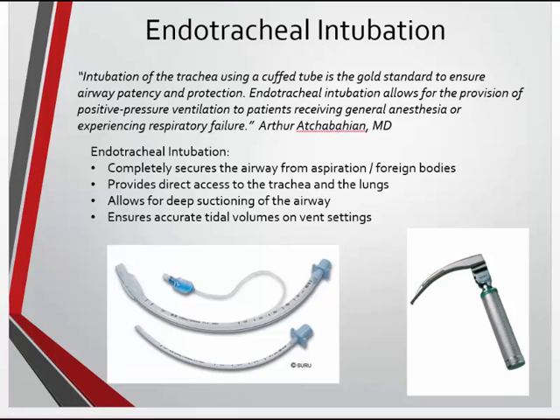My contention is that if you have the skill and ability to intubate a patient, which is the gold standard of protecting the airway, you should be doing that. And if you don't do that, your BLS airway is great until it's not. Once the patient vomits, once something else happens, there's swelling from inhalation burns or something like that, once you lose that BLS airway, it's going to be very difficult to get it back. So we should be doing intratracheal intubation. We should be using the equipment and the skill we have to do this. And I would highly recommend that if you have patients who require advanced airway control, that you are making intubation attempts as your first pathway to try to make that happen.